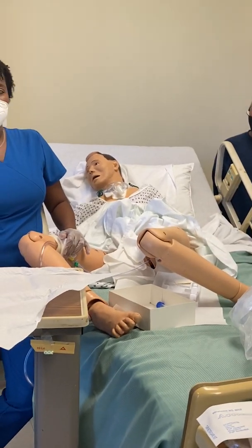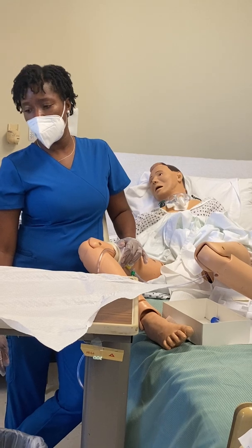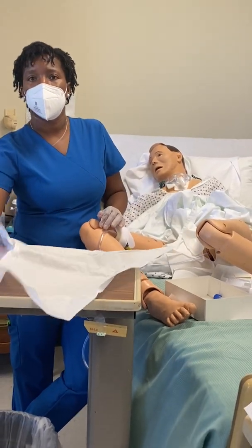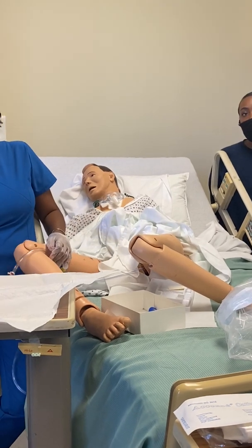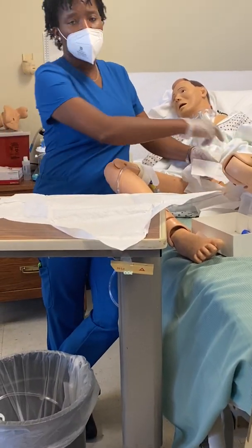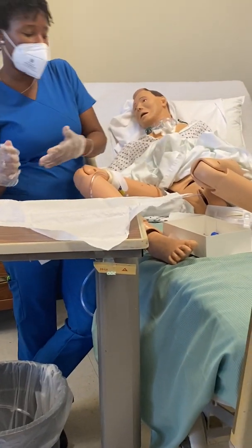Is there a certain way we gotta clean it up, like all this? No, you just grab it all up and put it in the garbage. Okay, I do have one question. When you've got that barrier around the catheter, do you have to rip it somehow? Yeah, it's paper. So you just rip it off. That's why it's paper.